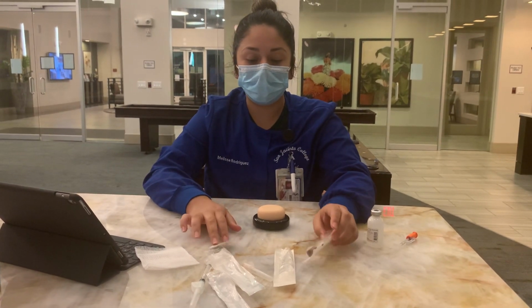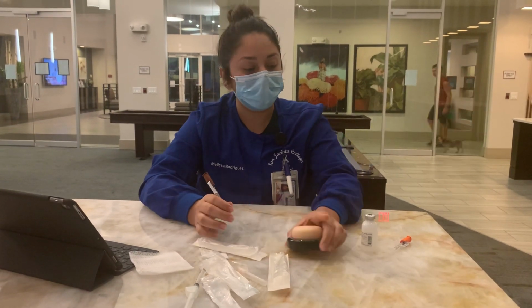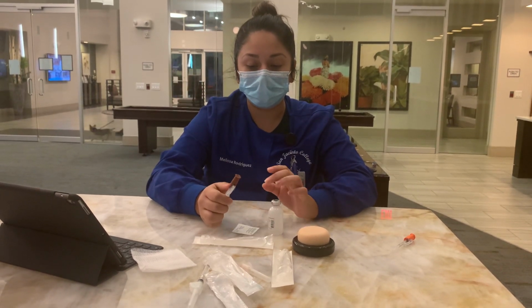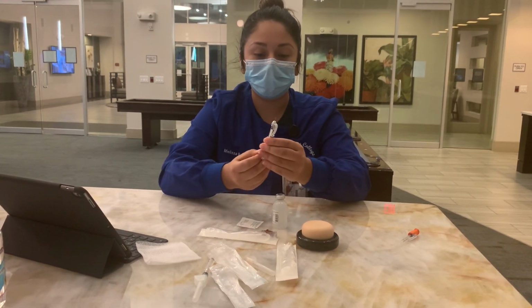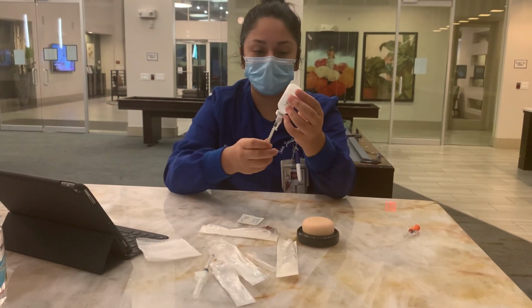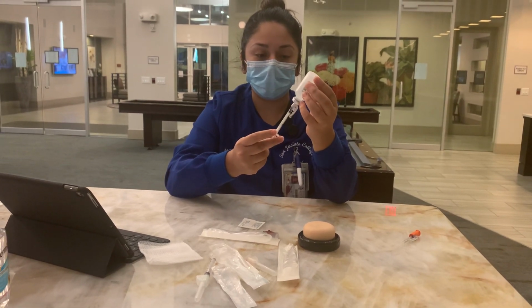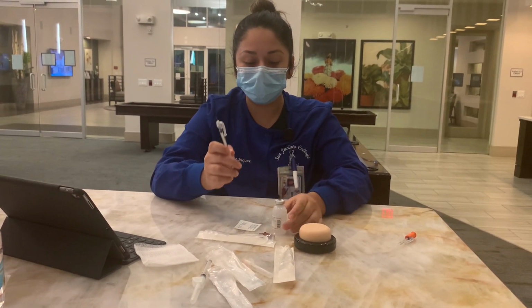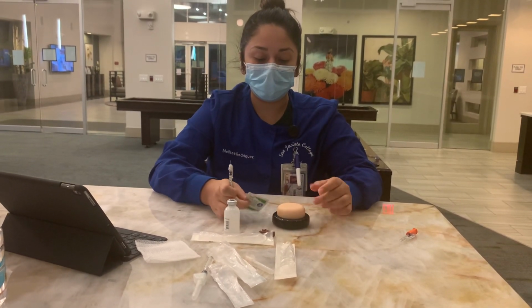Our last one would be intradermal, which is gonna be our TB test. I'm gonna remove the cap of my vial and clean it with an alcohol swab for 10 seconds. Once I've done that, I'm gonna remove the cap to my needle. I am going to draw back 0.1 ml, insert it into the vial, flip it over, push the air in, and draw it back. I'm gonna make sure I have the exact amount and assess my syringe for any air bubbles. We're gonna do the forearm for the TB. I'm gonna clean my site.